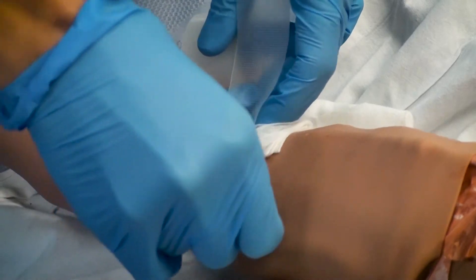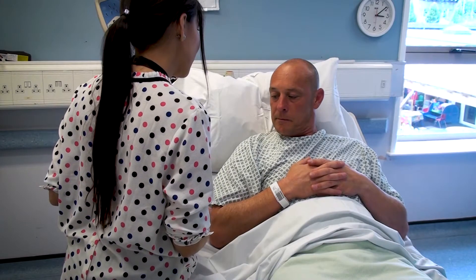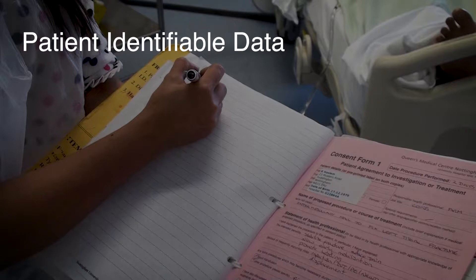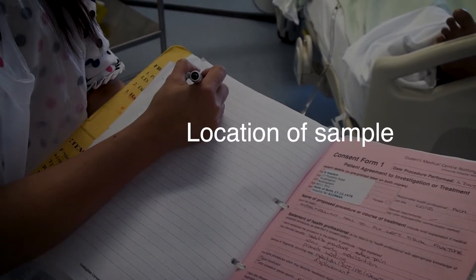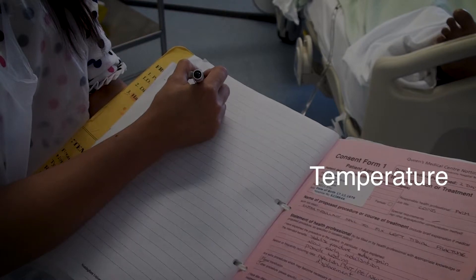Once five minutes of pressure has been exerted, check the wound and ensure that the patient is feeling okay and responding appropriately. For analysis you will need patient identifiable data — ideally a patient label with the patient's date of birth, name, and hospital number — the amount of oxygen that the patient is receiving, whether the sample is an ABG or VBG, and the temperature of the patient.